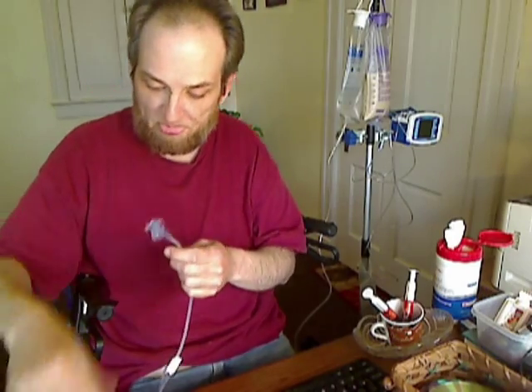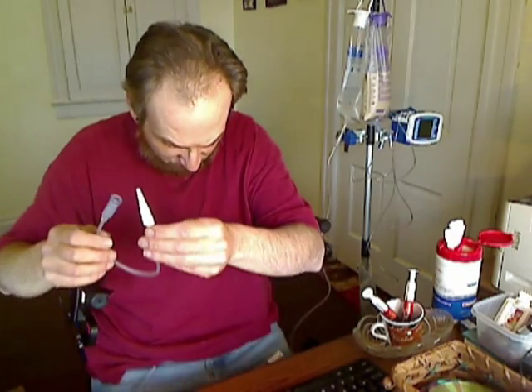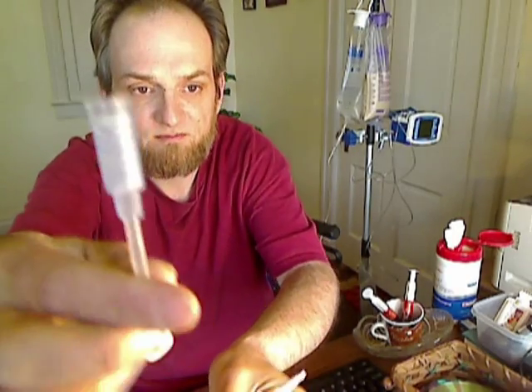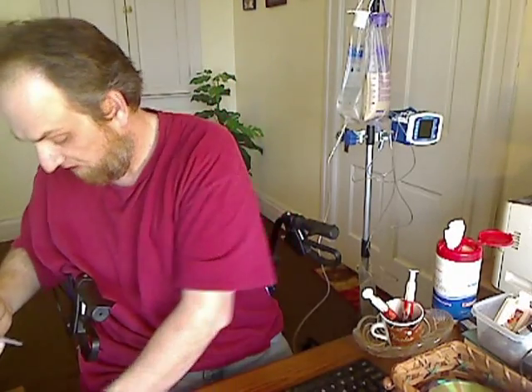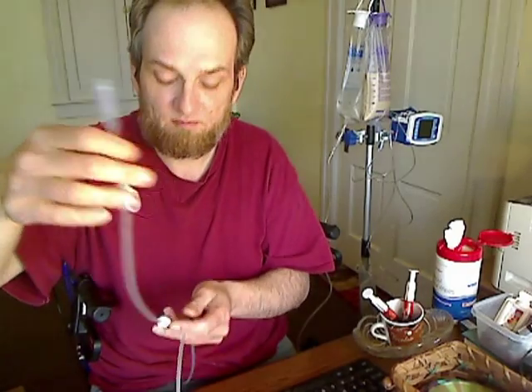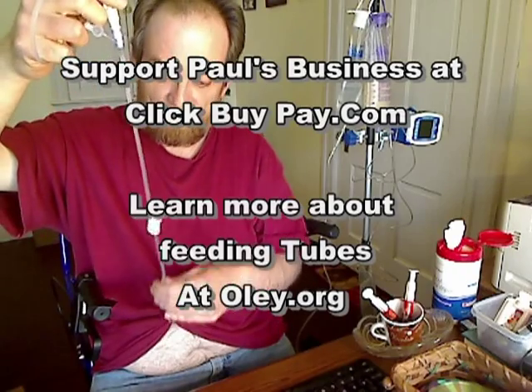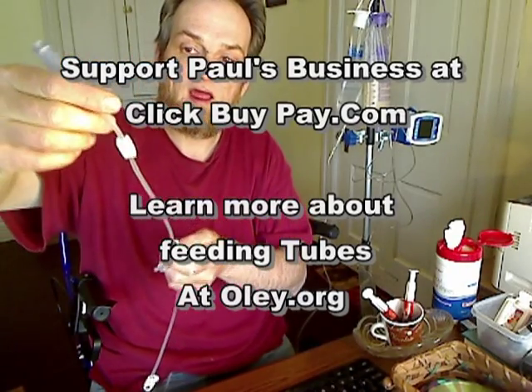Now what I do is, we have the clamp here. This clamp is keeping the stomach contents in. If this was open, everything would come out of the tube. What I do is I take a straight extension, and some of you folks should know about the straight extensions, but I just take a regular straight extension, and of course it has a clamp, and I put that in the large opening. So yes, I have my regular tube with a clamp, and then I have my little extension with a clamp.